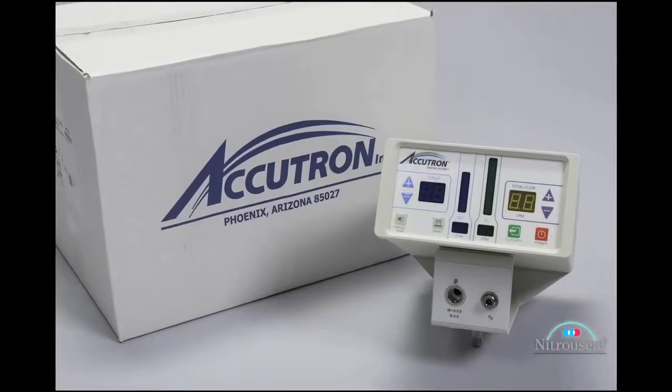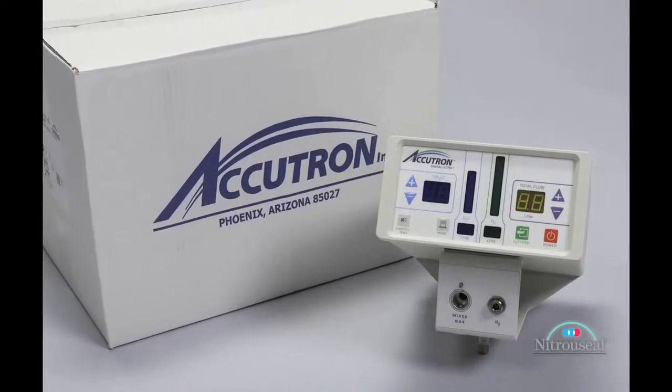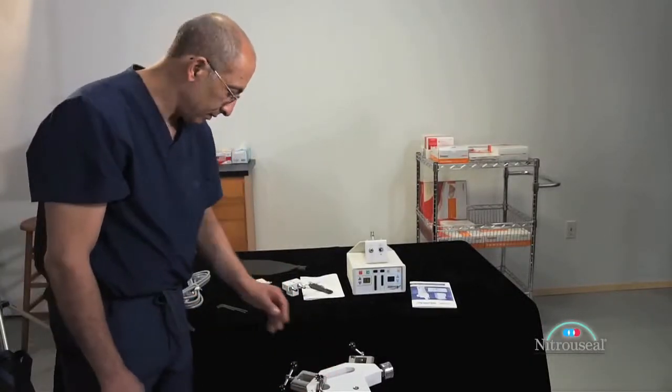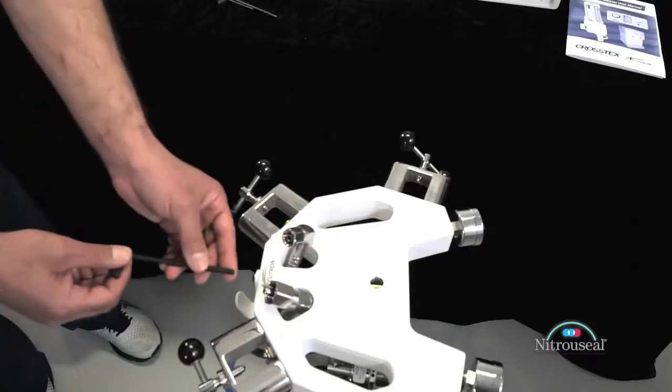Unpack the largest box marked Accutron carefully, checking to see that all the equipment is included and undamaged. Remove the flow meter from its separate smaller container. Place the mobile stand upright. You are now ready to attach the flow meter to the top of the stand.